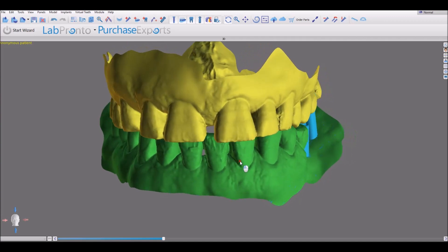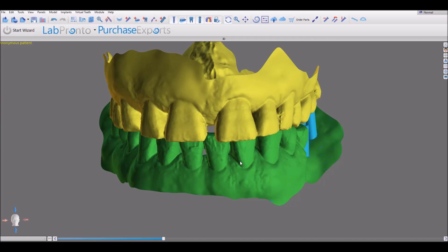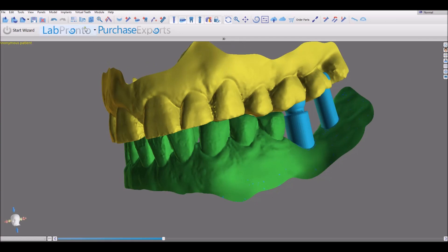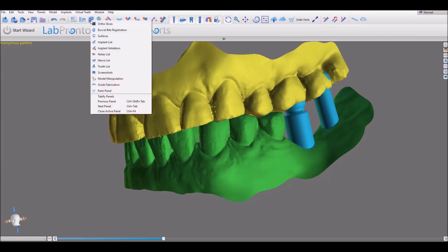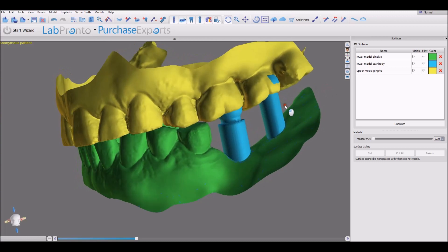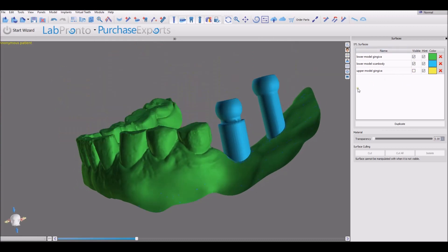If they do, great. If not, then we have other videos on orienting them properly, and also how to put the models in occlusion in relation to each other. We can open up the surfaces panel by clicking Surfaces. Here we can see the surfaces that we've imported into the software.